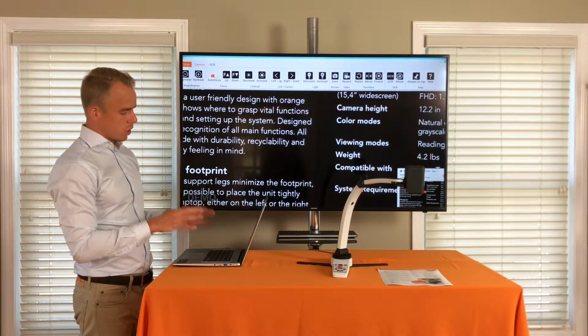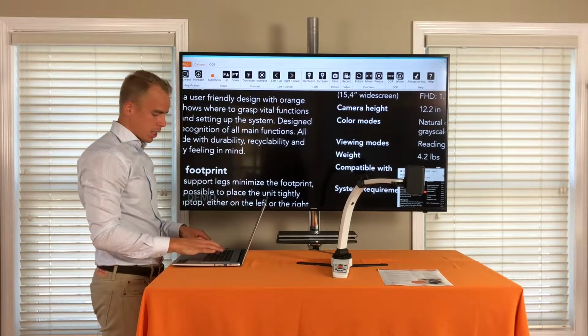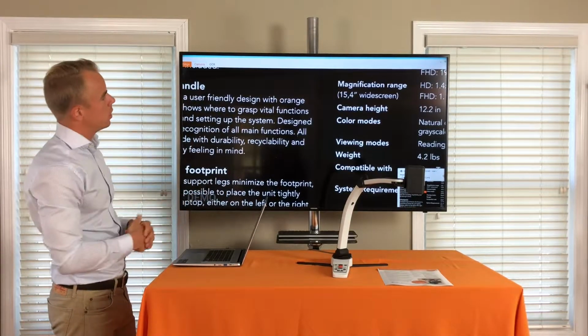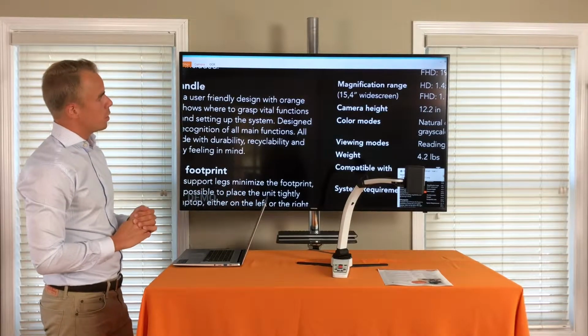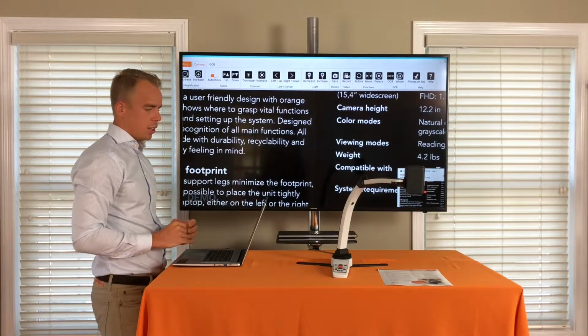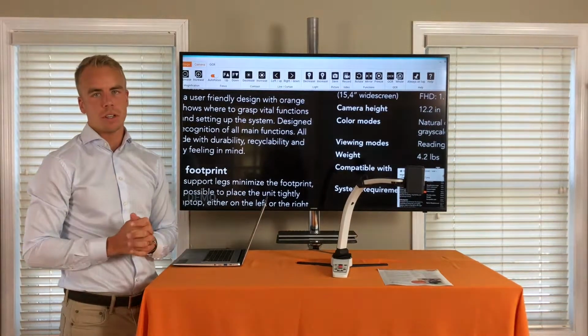If I'm only using the short commands, I don't need this icon bar. In that case, I can press Ctrl H to get rid of it, to get a larger view. I'll add it back. The other part I'm going to show you is text-to-speech, OCR.